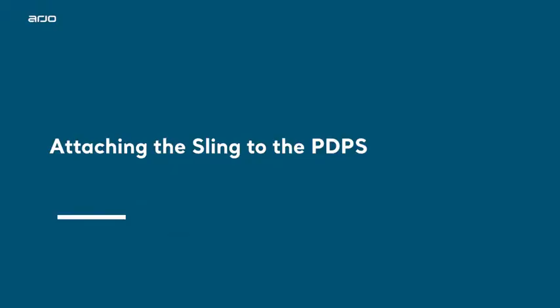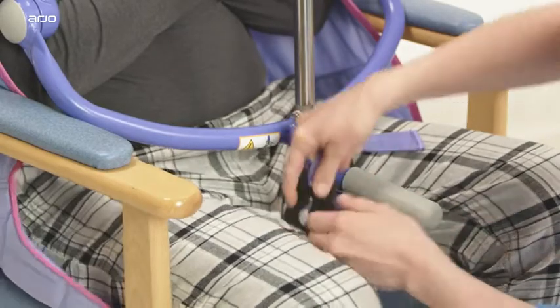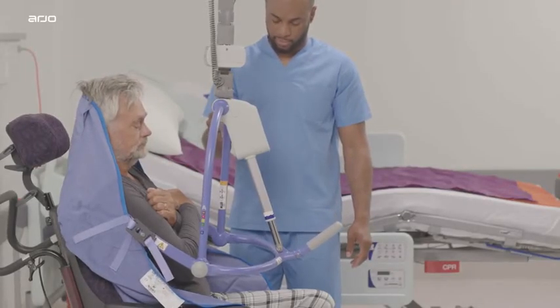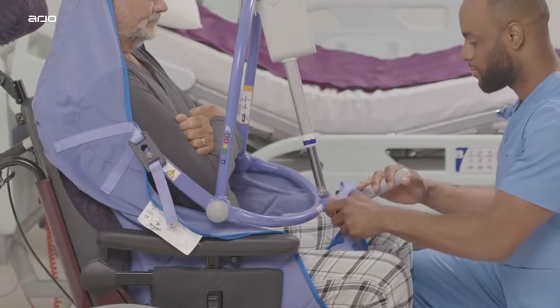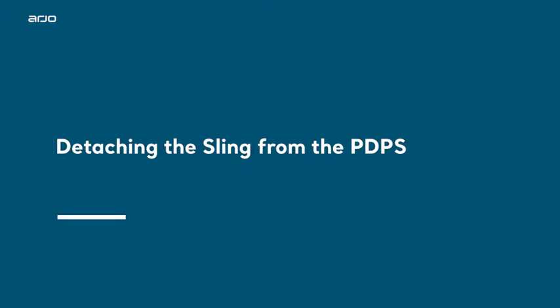Attaching the sling to PDPS. Insert the clip attachment over the lug on the PDPS. Apply the leg clips of the sling onto the lugs, so that they become positioned vertically. Secure the clip in place by pulling the sling down, so that the lug is in the top portion of the clip hole. Detaching the sling from the PDPS.